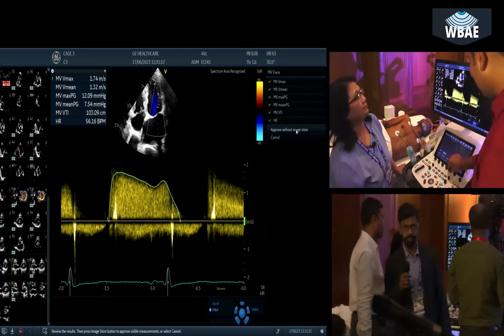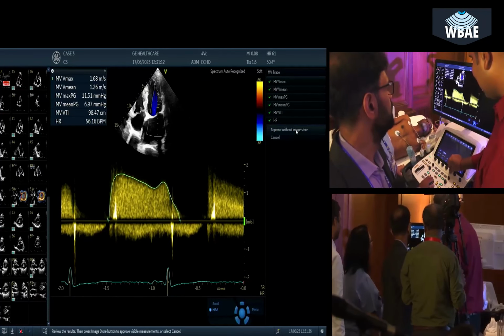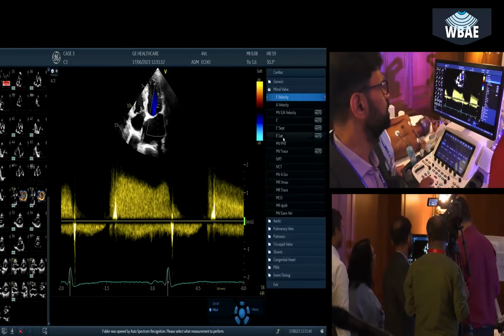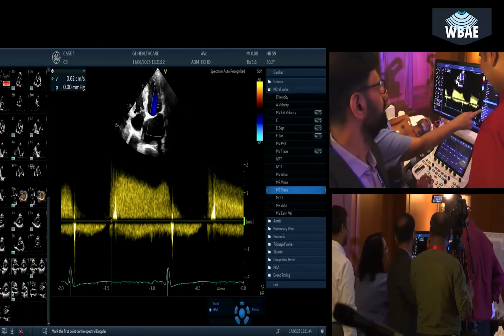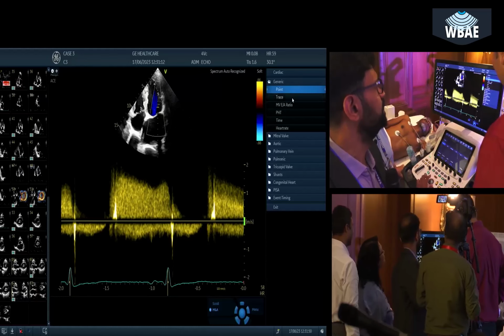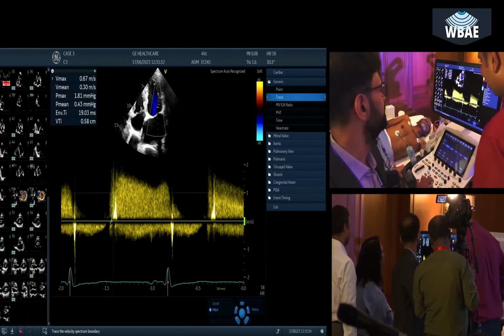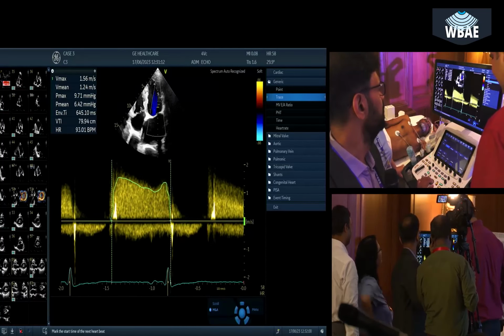No, it is not tracing correctly. You have gone into the early part of systole, not tracing correctly. I think I will do it manually. That's the problem with artificial intelligence. Yeah, Ashish is laughing. This is the MR trace. Where is the mitral valve trace? Let's do it. I always prefer to go and do it here. No, trace it. Mean velocity. You should always measure.